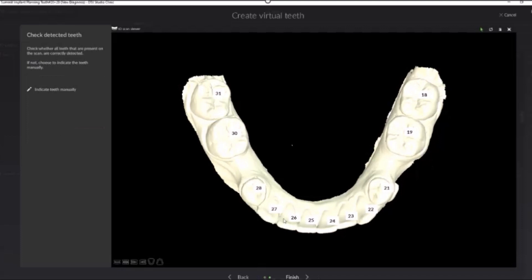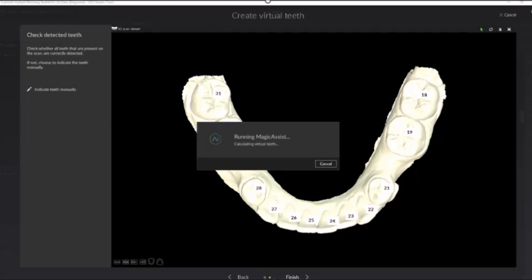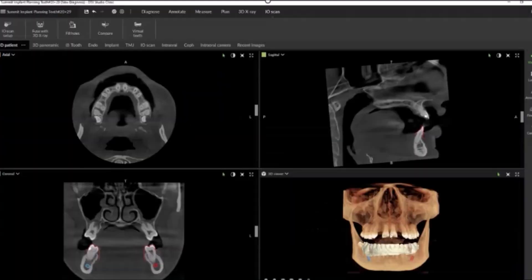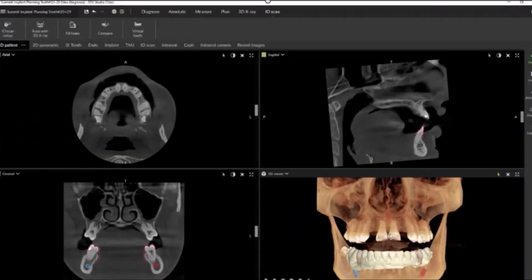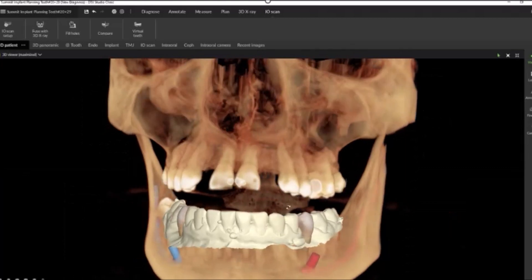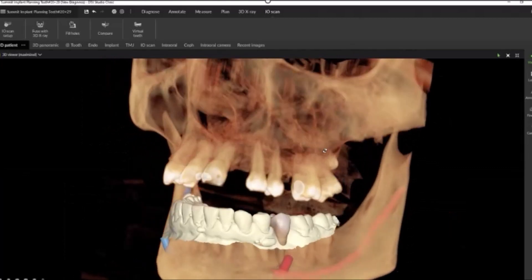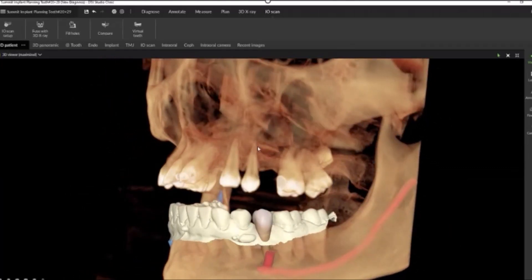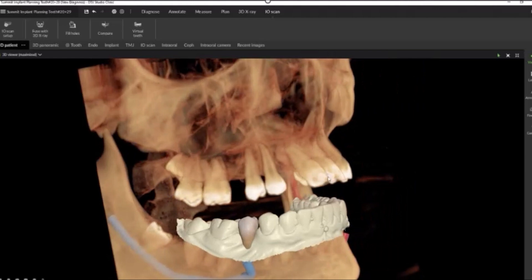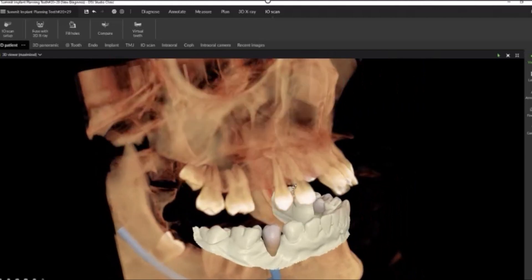Finally, it will analyze the current intraoral scan data and create restorations based off that data that match the patient's current anatomy and dentition. As I zoom in and inspect each restoration, notice how nicely these proposed crowns fit with the patient's current teeth.